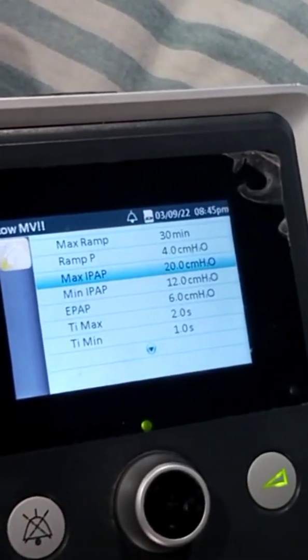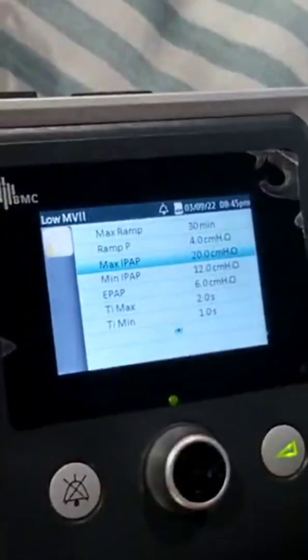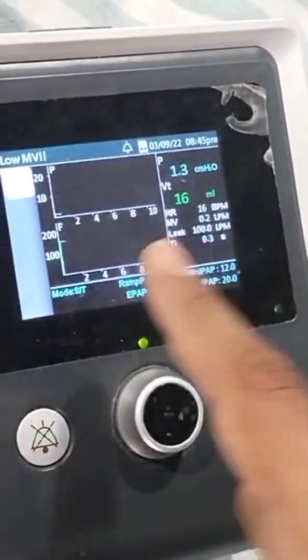The setting is available for the breathing pressure. To return to the main menu, press the button. You can feel it but you can't see. That's all.